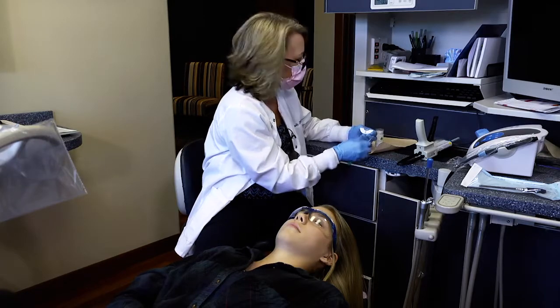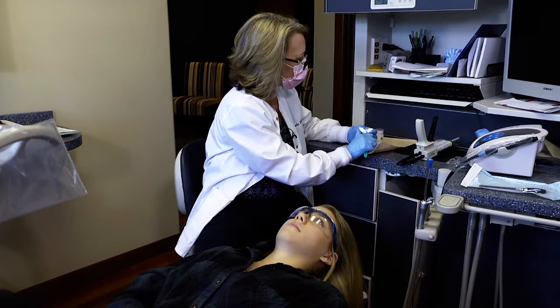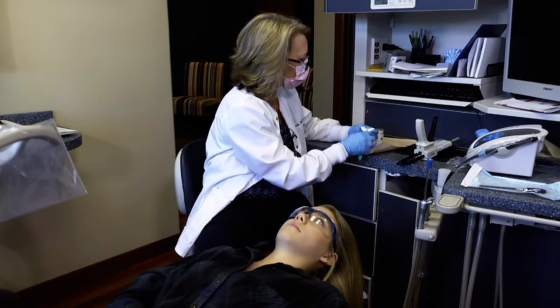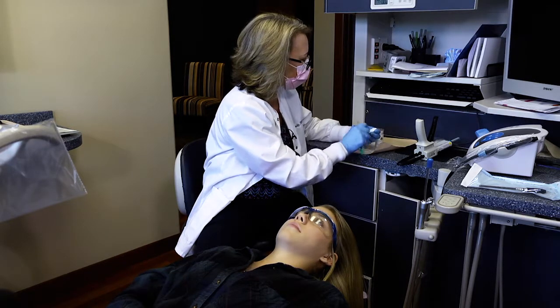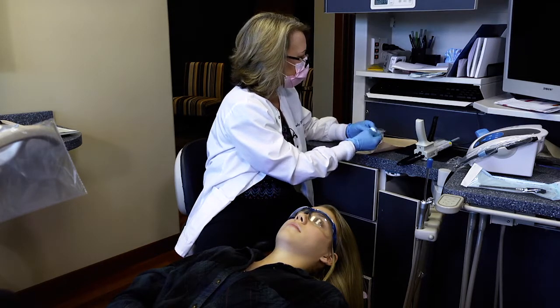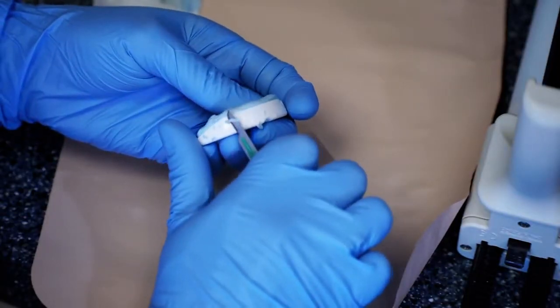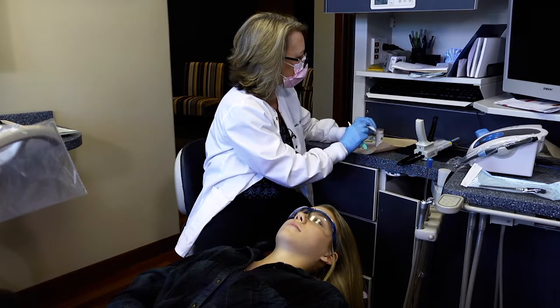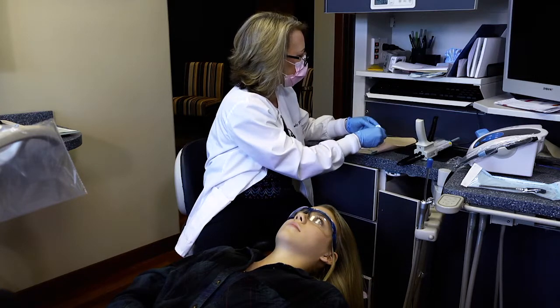In this anterior, in the midline, I want to make sure that this is trimmed flush, but I don't want to dig it out because it's going to help hold the bite registration. For me, I typically will either use my finger or the blade to make sure that it's nice and smooth. And the same thing on the anterior. If we have material that's gone out over the labial of the QuickSplint, we can trim that as well so that Jenna's upper lip isn't being caught on that. And we're going to try to make it as comfortable as possible.